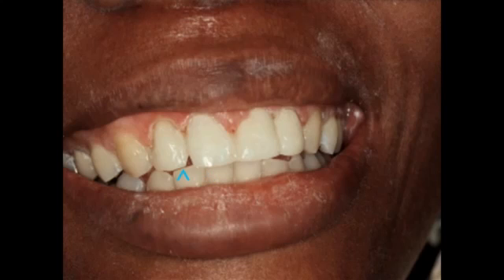Now, when was the last time that you reproduced subtle enamel highlights on an anterior tooth in the patient that you're doing veneers for? It just won't happen. If you were capable of doing this freehand, when you cure it, you're going to have an air-inhibited layer that needs to be polished off. And when you polish that off, these subtle enamel irregularities that are now reproduced in composite that is not air-inhibited would be polished away. Now there is flash, and you can see the flash here at the cervical.